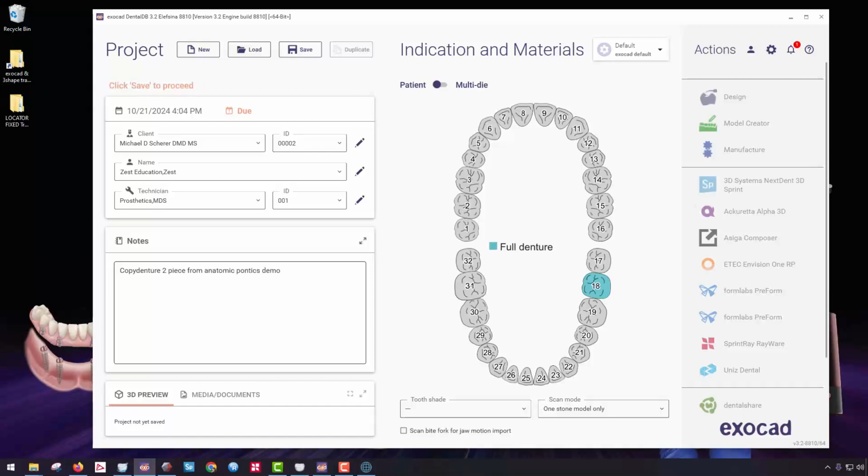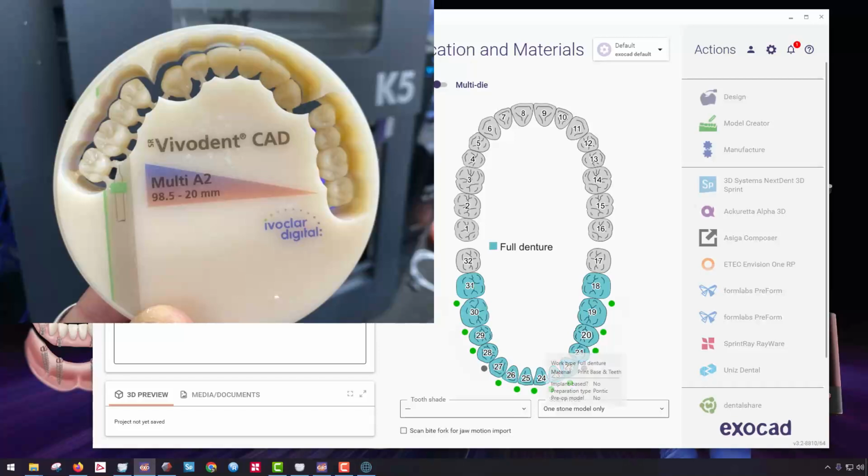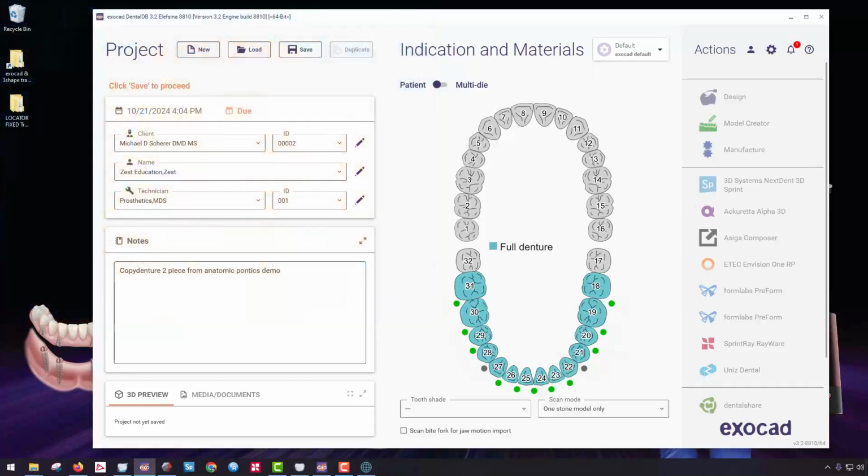Hold the Shift key down on my keyboard. I'm going to click over to tooth number 31. In exocad, if I wanted to make a one-piece segmented tooth arch, I make sure all of these little green buttons are on. But every now and then I like to do quadrants. So if you want to do quadrants, where I have teeth 18, 19, 20, and 21 as one piece, 28 through 31 as piece number 2, and teeth 22 to 27 as piece number 3, that's how I would set it up. I would just turn these green orbs on or off.